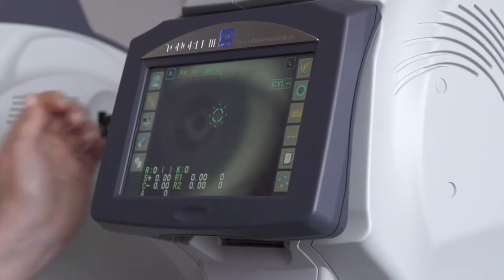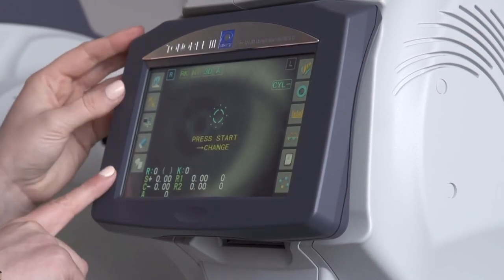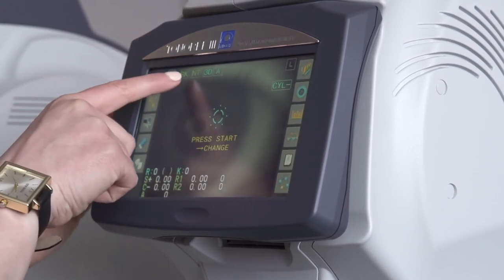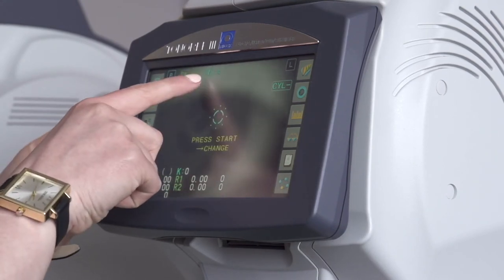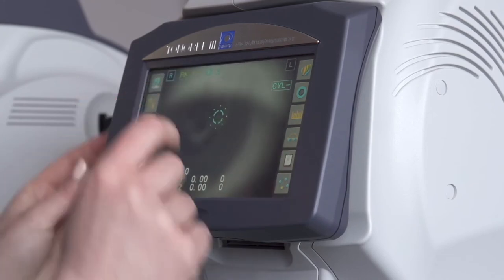Once we've got the patient lined up comfortably, we want to check we've got the right mode selected. Here I've got all measurements to be taken, which is RK, NT. I've also got my auto tracking and auto shot function active.